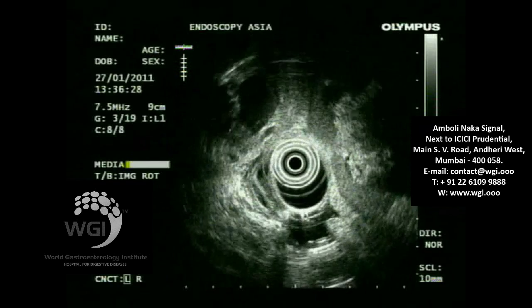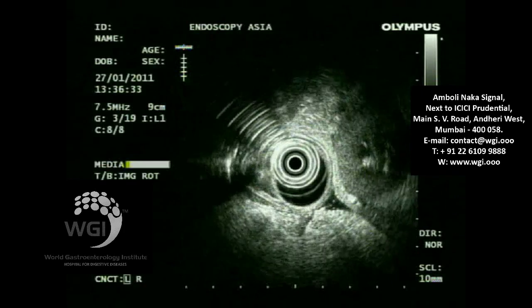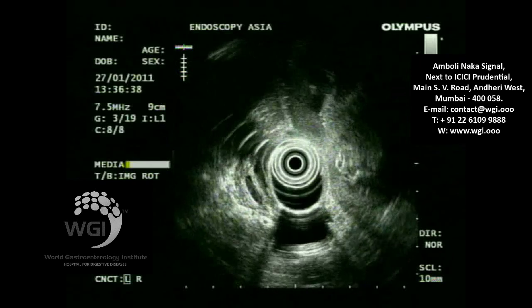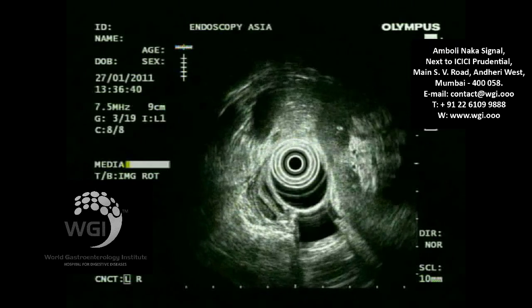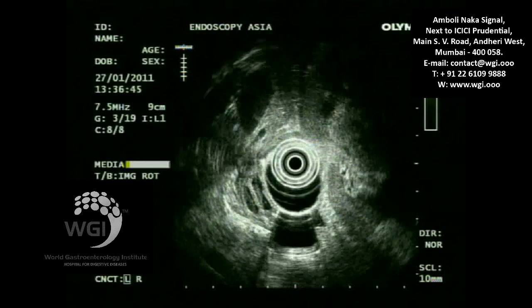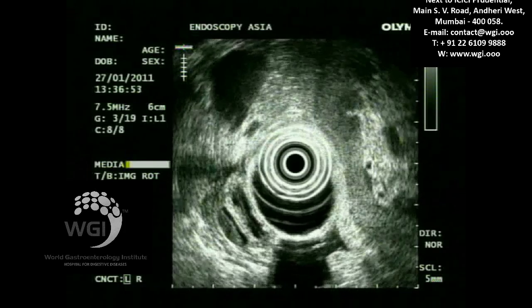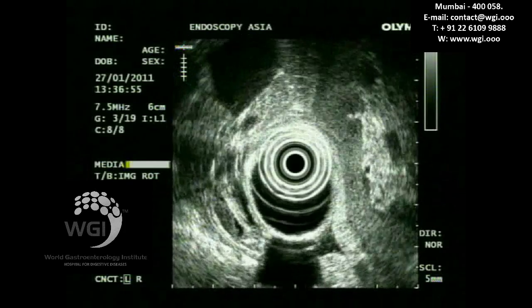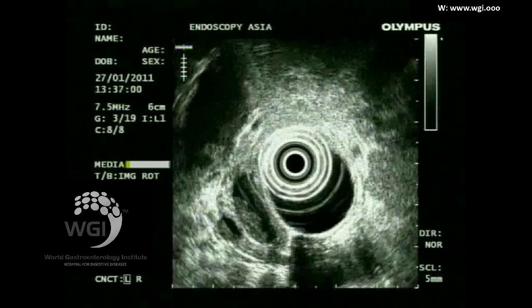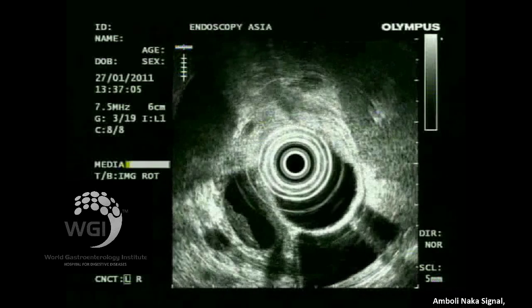You can see some free peripancreatic fluid because of pancreatitis. You can see here at 5 o'clock position a small pocket of fluid there. So absolutely no doubt this patient needs an intervention. We know that there is no obstructing mass lesion in that area, but you can see the reflux. This is how pancreatitis sets in, perhaps, when there is obstruction of the lower end of the ampulla.